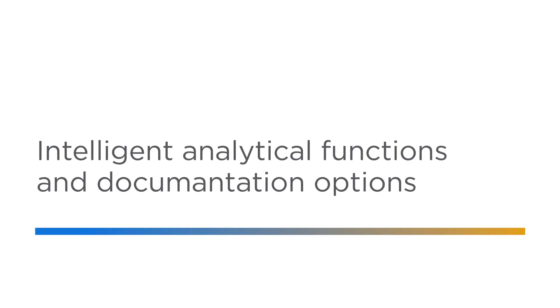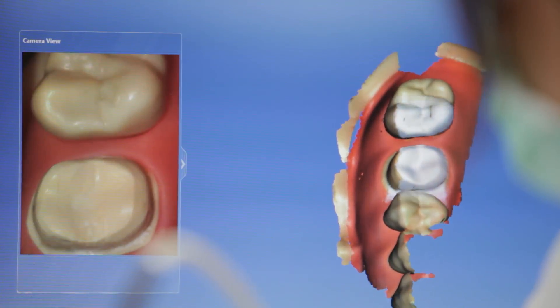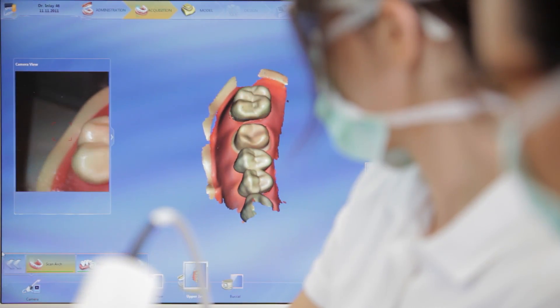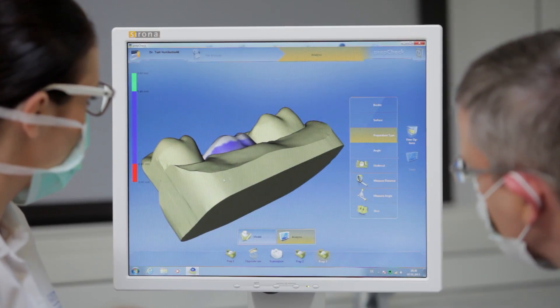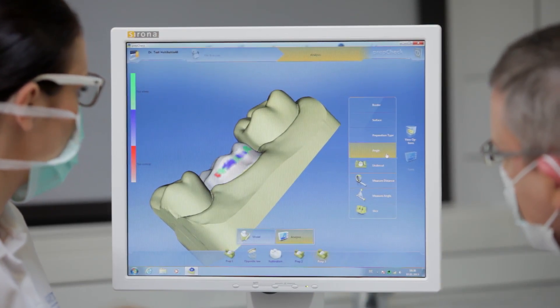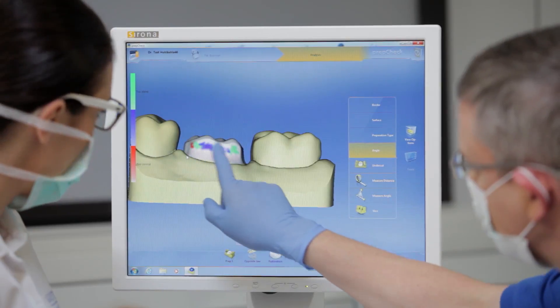The system provides intelligent analytical functions and documentation options. The Omnicam intraoral camera allows the dentition and preparation site to be three-dimensionally scanned accurately and quickly. PrepCheck immediately calculates the scanned recording and reconstructs it into a 3D model in natural color. The software checks the preparation by means of various measurement and analysis functions: distance to the neighboring tooth, preparation margin, precise marginal edge, as well as the angle and curvatures of the tooth surface.